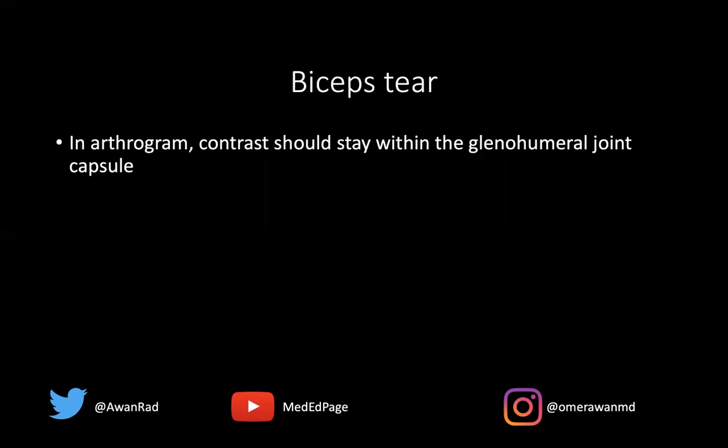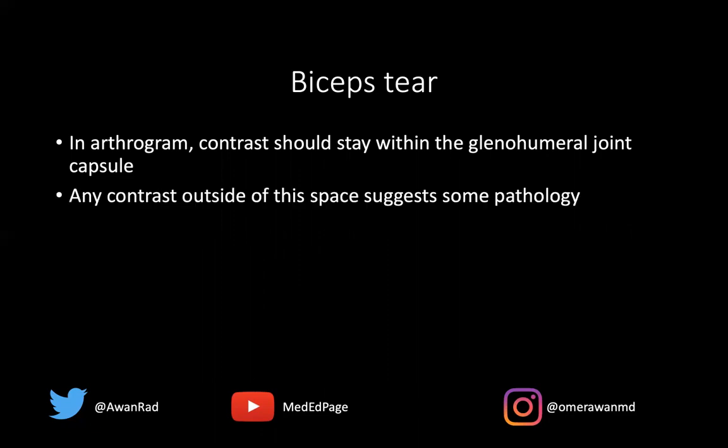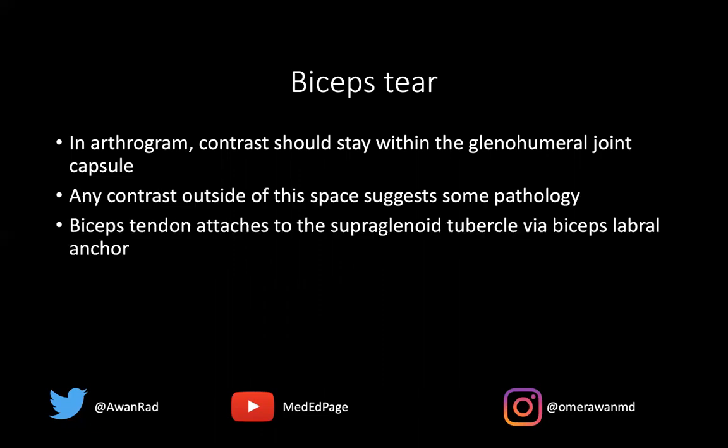Biceps tears are relatively common in an arthrogram. The key is to understand where contrast is going and where it's not supposed to be. Contrast should always stay within the glenohumeral joint capsule. If it goes anywhere else, it means some structure is torn. If it goes into the subacromial subdeltoid bursa, that means there must be a full thickness rotator cuff tear. In this case, we saw contrast or fluid within the substance of the biceps tendon itself. The biceps tendon normally attaches to the supraglenoid tubercle via the biceps labral anchor.